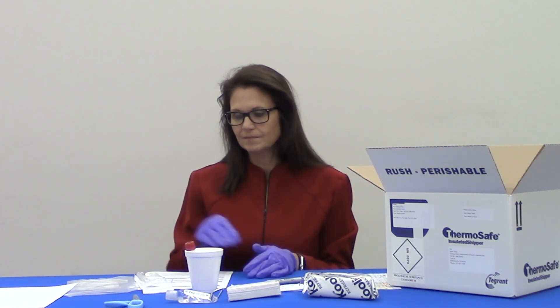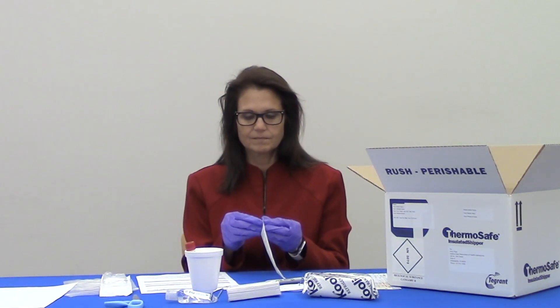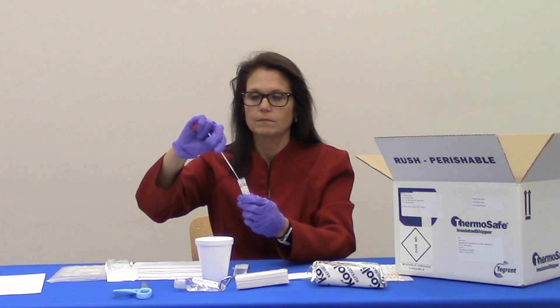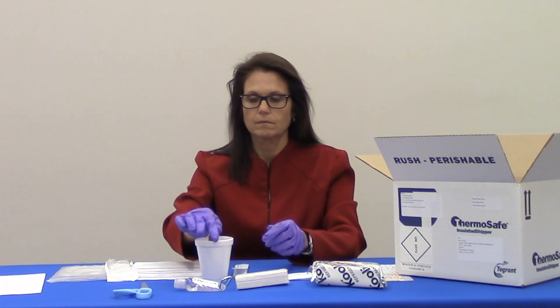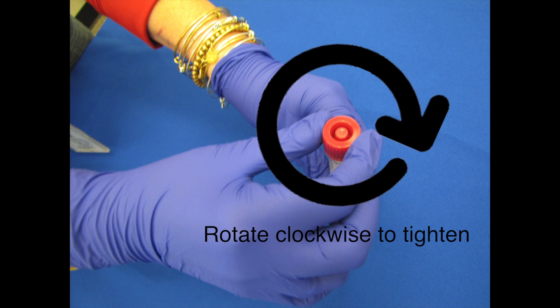Remove the swab from the packaging, being careful not to touch the swab end. To take the nasal specimen, tilt the head back slightly and gently insert the swab one inch into one nostril. The swab should be parallel to the roof of the mouth, not pointing upwards — the entire swab tip should be in the nostril. Rotate the swab three times. After collecting the nasal swab, immediately remove the cap of the transport tube and insert the swab fully, making sure the swab tip is fully immersed in the transport liquid. Break the swab at the breaking point with your hand or scissors, then tightly screw the cap back onto the transport tube.